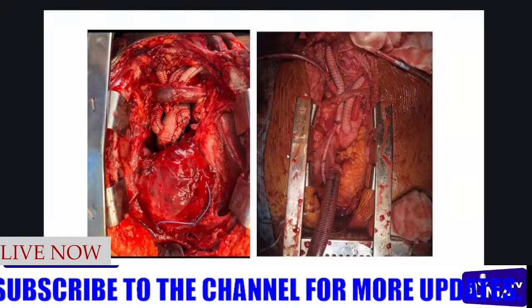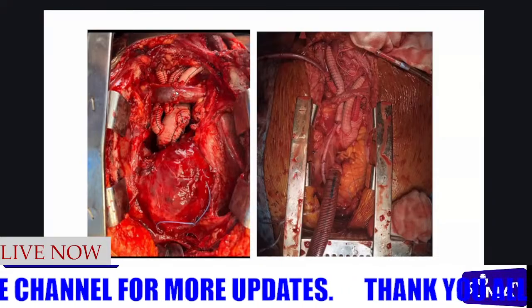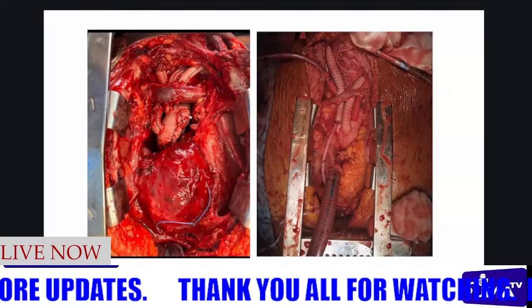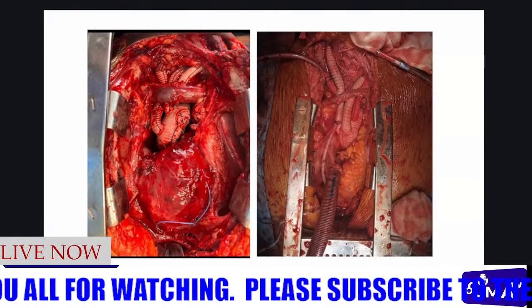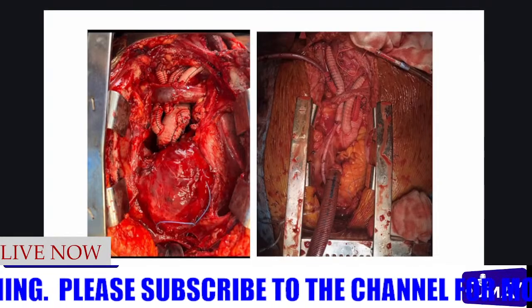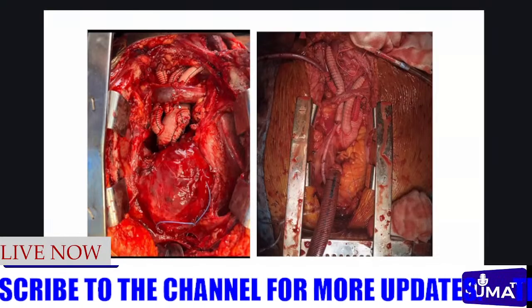So these are some of the patients we've operated. I hope I'm not scaring anyone. First picture, we replace the root, the aortic valve, ascending, and all the arch branches. You can see the tube we put has three branches.